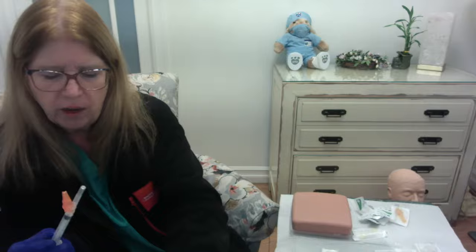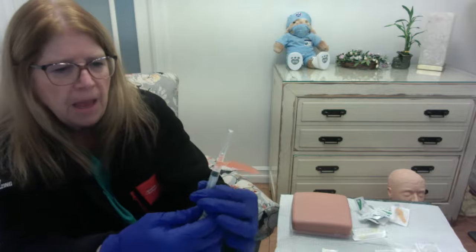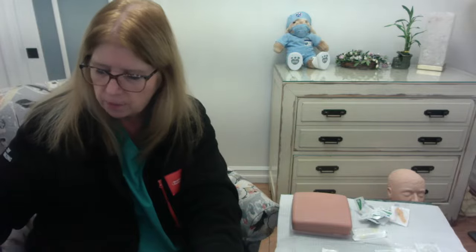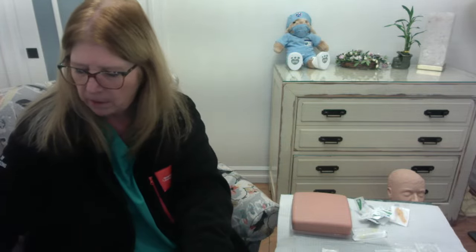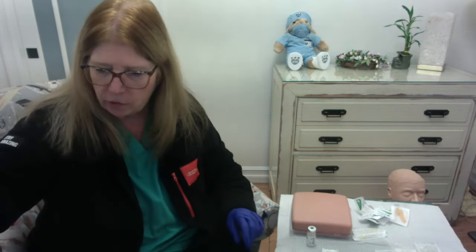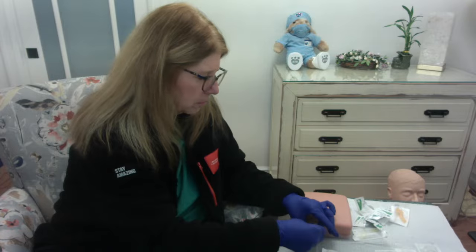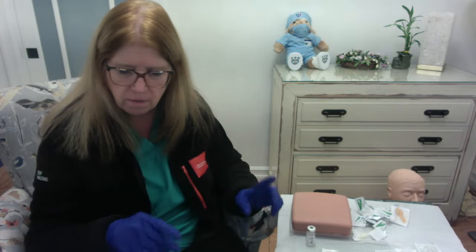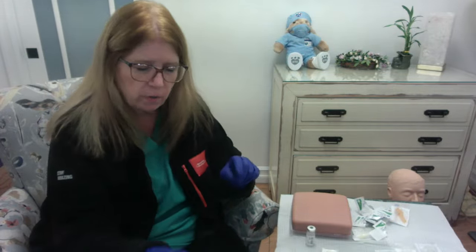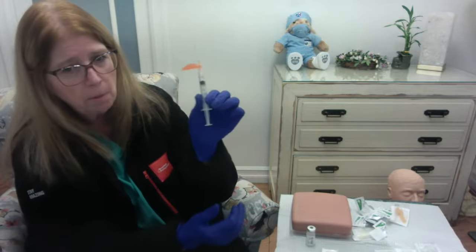So I'm going to take this out, and you'll kind of recognize this side piece. I want to kind of get it out of my way. And let's say, I don't know, what can we give subcutaneously? Hey, let's give some heparin subcutaneously. Okay, so I'm going to take a vial of heparin, and I'm going to clean off the top of the vial, 30-second scrub, okay, and I need to give 5,000 units of heparin, which is in 1 milliliter of solution. So I'm going to pull back my plunger to the 1 milliliter mark.